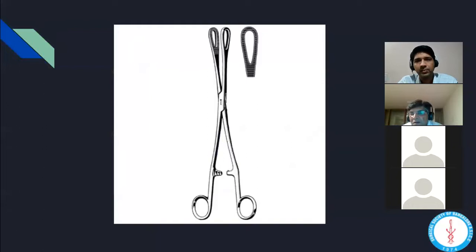Yes, sir. One thing for the students, the ratchet is there just to hold the tissue, and one click is sufficient. You don't have to hear the noise or click as if the entire 5 jaws of the ratchet is utilized, because one click is sufficient to hang on to the tissues, and tissue respect is extremely important. The more ratchets you use, the more trauma it will cause, even though it is an atraumatic forceps.